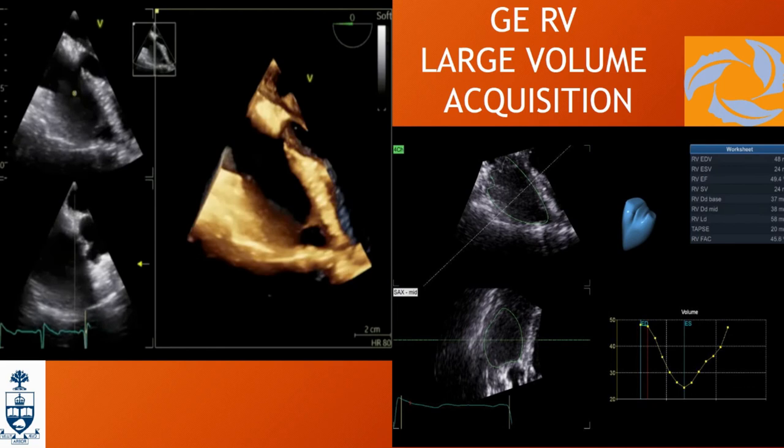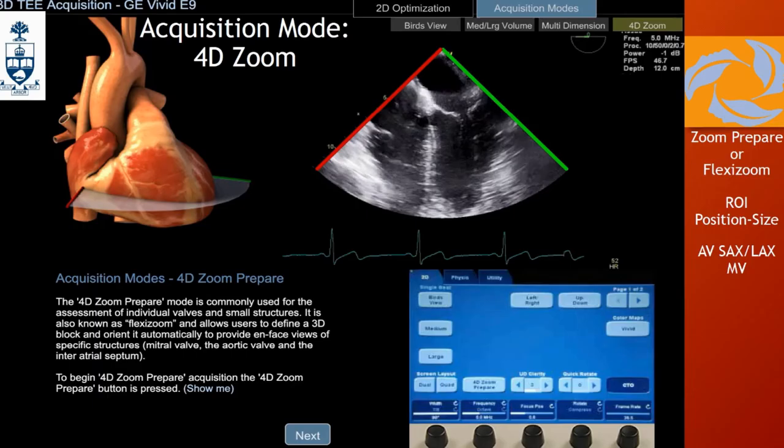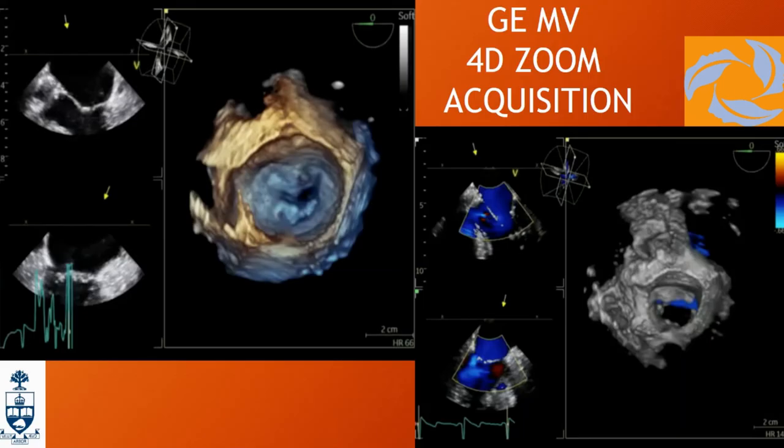Finally, the 4D zoom — this is the GE equivalent of 3D zoom on the Philips, same principle. It's just a little block: you go to 4D zoom, prepare it, get the region of interest, move it where you want, increase the size, and once you're done you go right and structure everything. When you're happy with the sector, press to generate the image, and then manipulate it from there. Examples include the mitral valve — with color you just press color and get those lovely images for the surgeon.